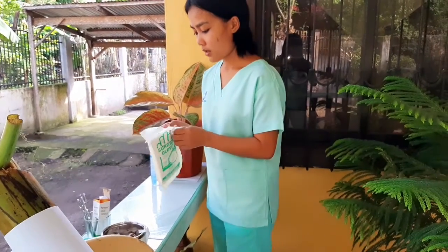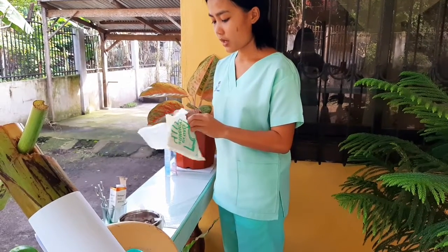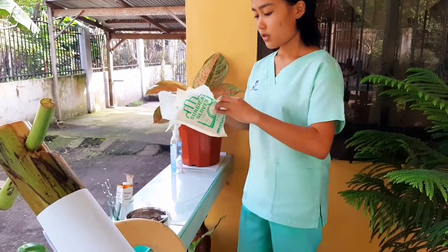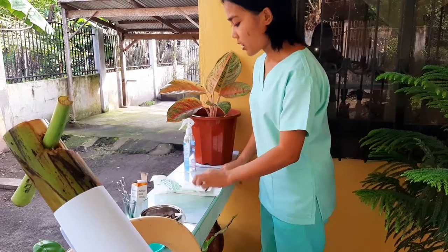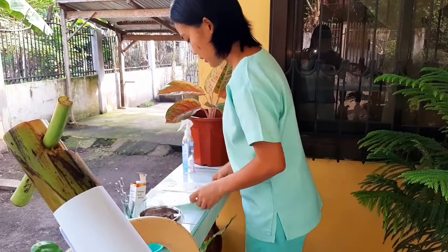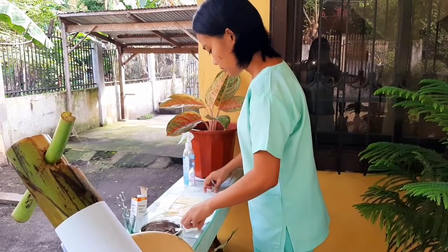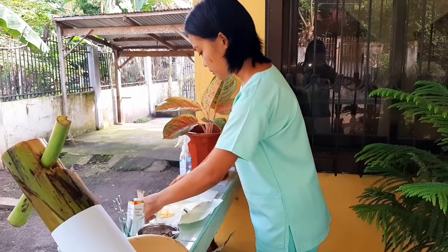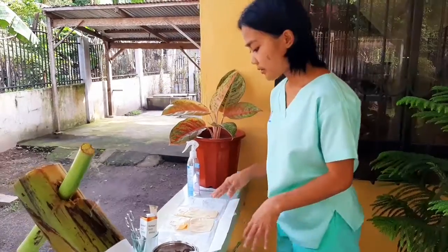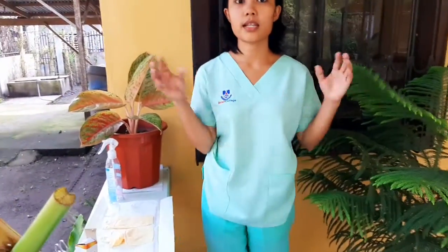Make sure to be careful in opening the sterile gloves, because once they touch something non-sterile, they become non-sterile. Here we have the sterile gloves. The technique is skin to skin and gloves to gloves.